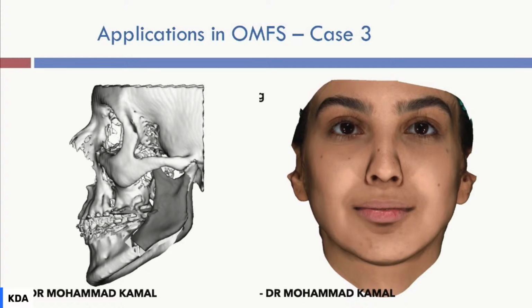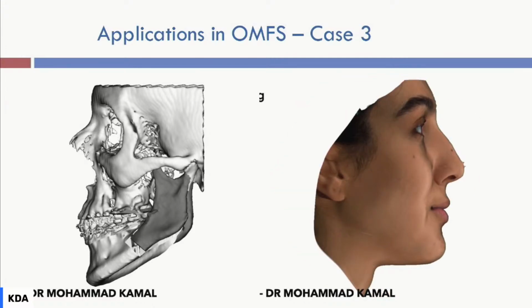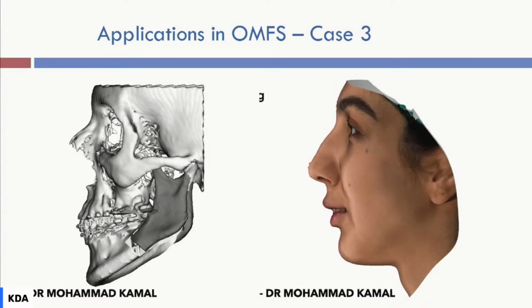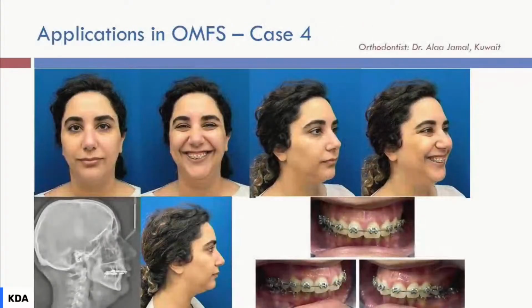Now I transfer this into soft tissue prediction. This is again from the RAM of the computer, because it has to. So same thing, before surgery, simulation of the surgery, before surgery, simulation of the surgery, and then we come up with a new algorithm. The more surgeries we do, then we can go retrospectively evaluate the actual response, and we put it in an algorithm so that our prediction becomes better in the future. So this is what artificial intelligence is about. Doing something and keep working on improving it.